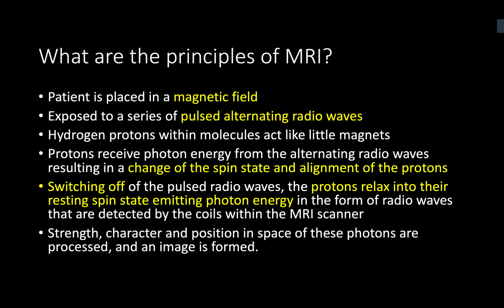And when a radio frequency pulse is applied to the cells, then the hydrogen ions will revert to a perpendicular orientation, and removing the pulse of radio frequency results in the hydrogen ions returning to their natural states in two forms, called the T1 and the T2 decay. And this is picked up by the MRI machine and translated to images.